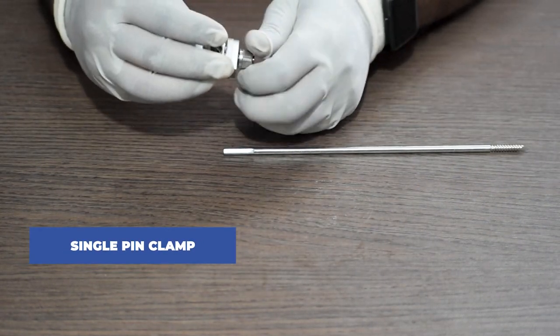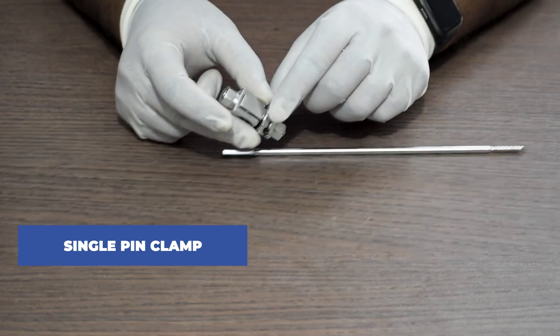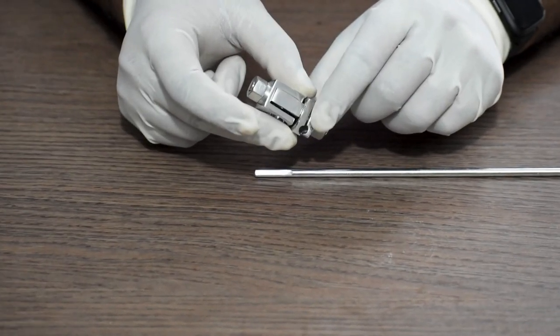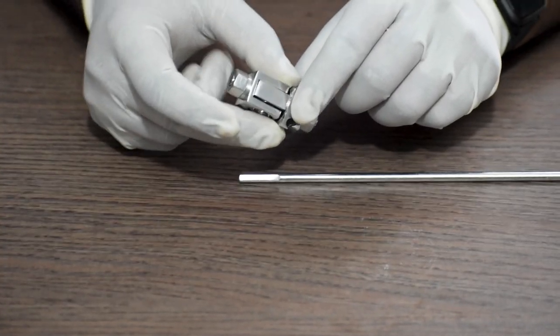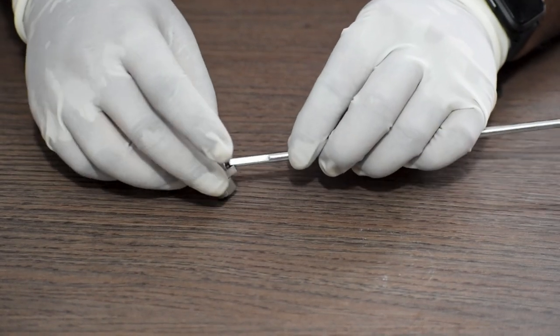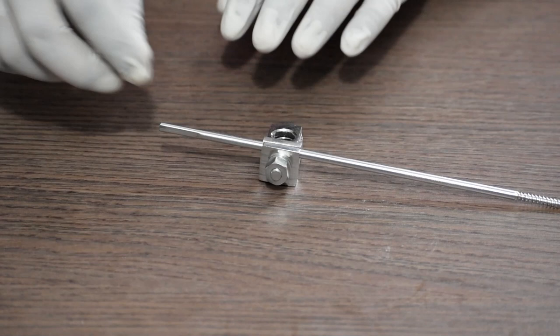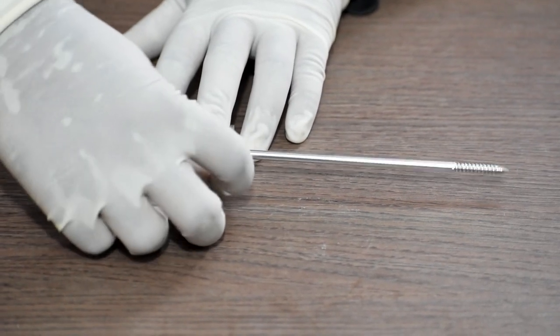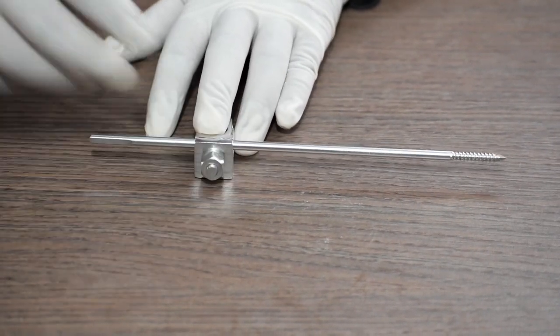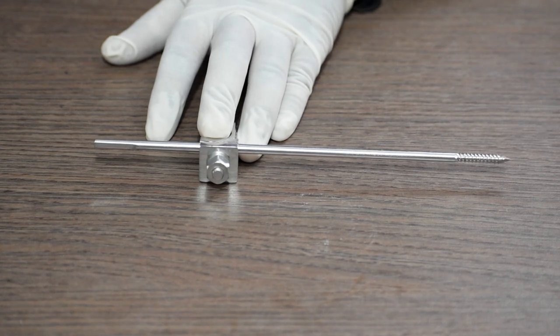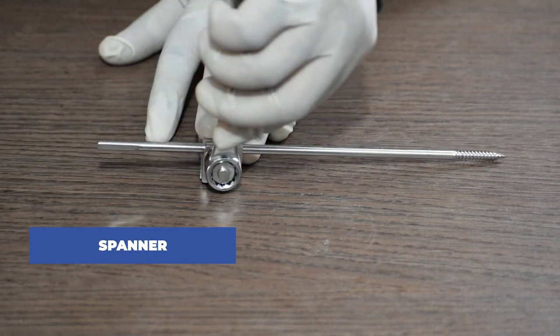Next we take the single pin clamp and we insert the Schanz pin through this pin fixator. Once inserted, we will tighten the nut with the help of the spanner.